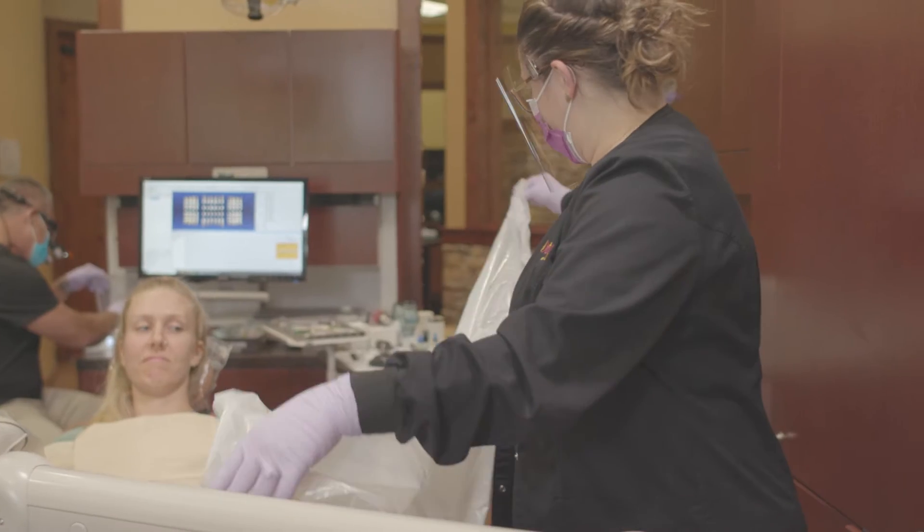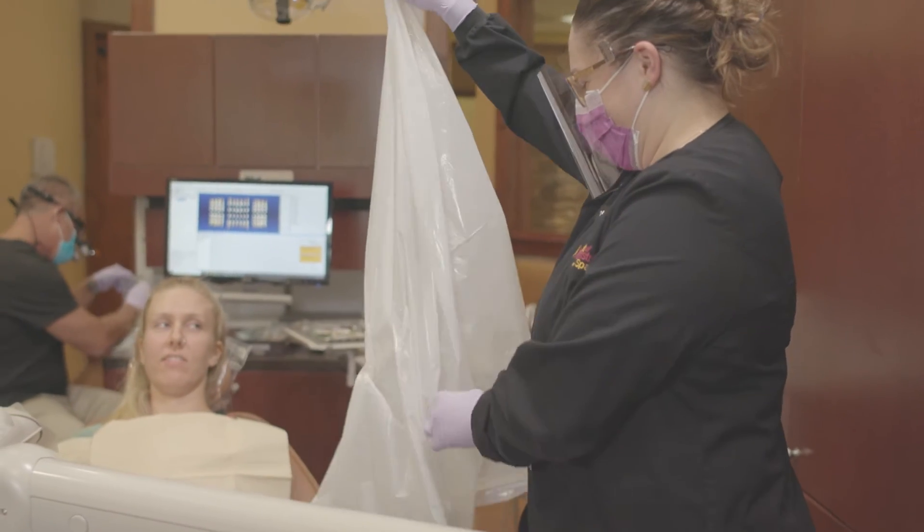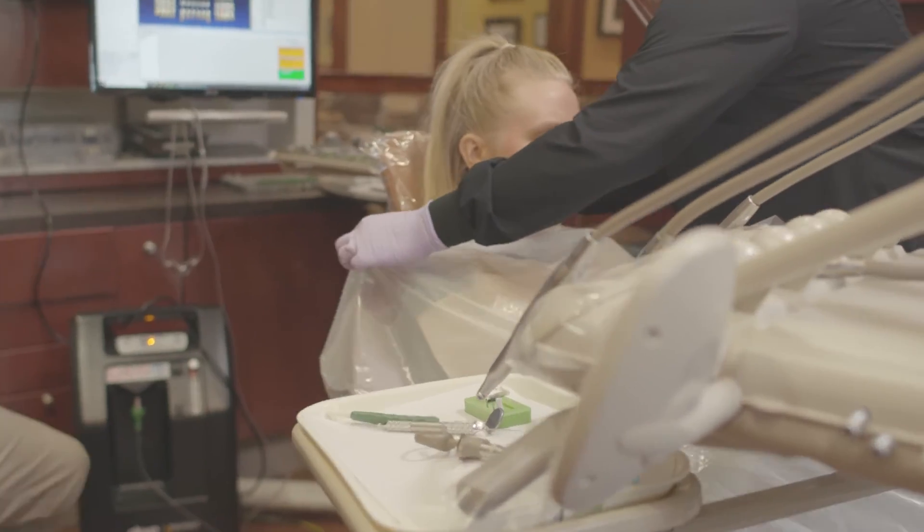Next, we use a clear plastic barrier that we place over your entire body, right up to and including your neck, to make certain that any refuse, overspray, or contaminants that enter the atmosphere don't land on your clothes and get taken home to your loved ones.